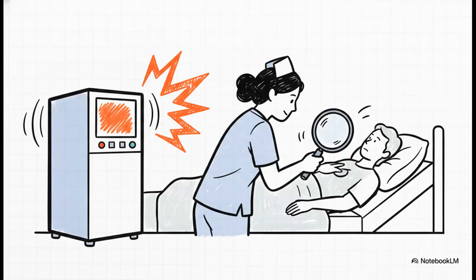So here is the absolutely crucial takeaway. This is the ultimate golden rule of nursing when dealing with ventilators. When that alarm sounds, you do not look at the blinking lights on the screen. First, you check the patient. You look at their chest, their color, their distress level. Only after you have assessed the human being do you turn your attention to check the machine. Always, always the patient first.